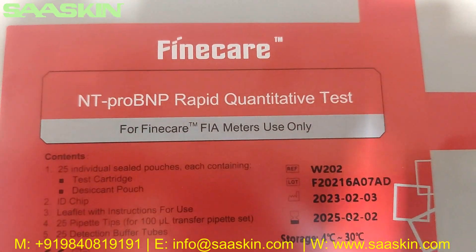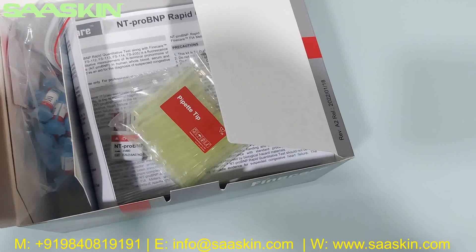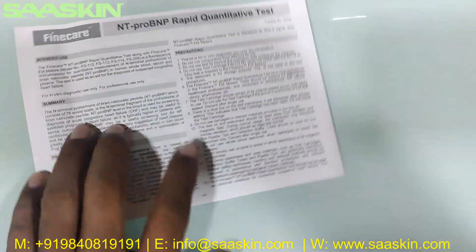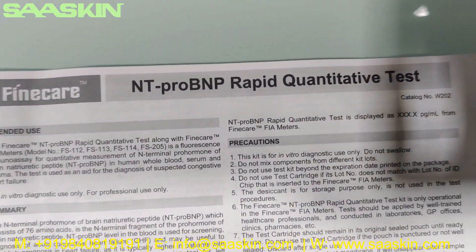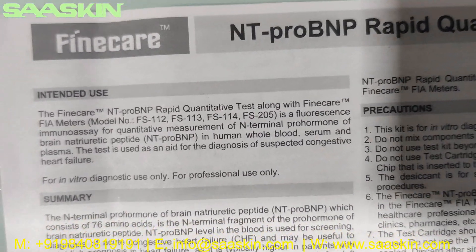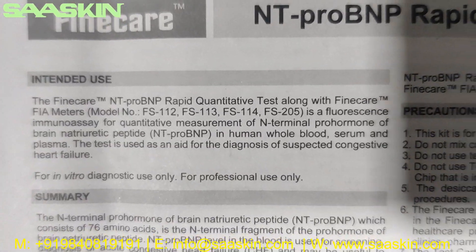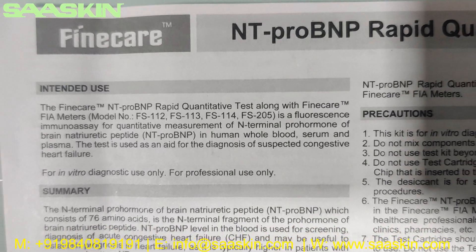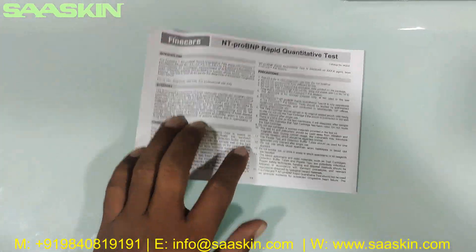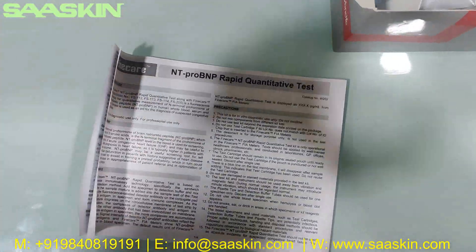This is the Fine Care NT Pro BNP Rapid Quantitative Test. I'm going to unbox this for you. Here's the manual — it talks about the Fine Care NT Pro BNP Rapid Quantitative Test along with the Fine Care FIA Meters. It's a fluorescence immunoassay for quantitative measurement of N-terminal pro hormone of brain natriuretic peptide in human whole blood, serum, and plasma. This instruction manual covers the basic test preparation procedure, test conducting procedure, how to interpret results, how to collect specimens, and the complete test procedure.